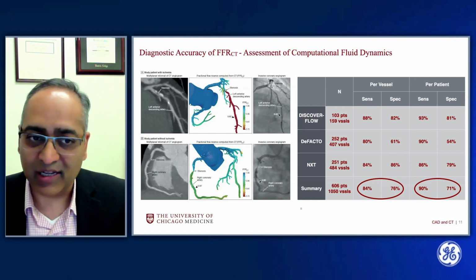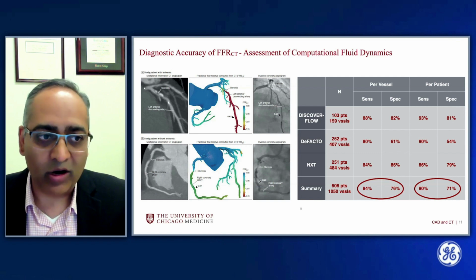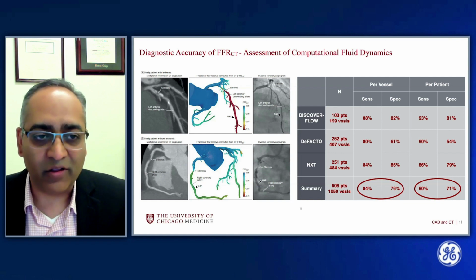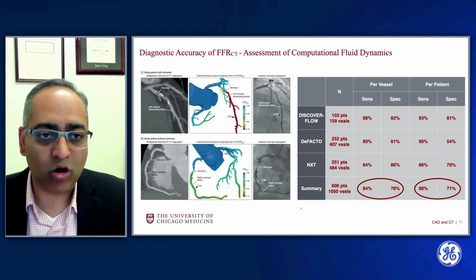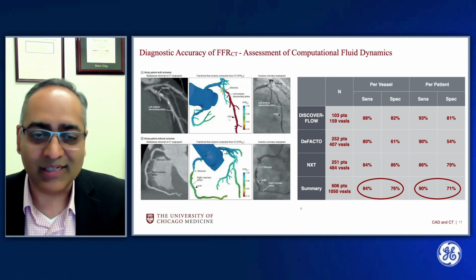I don't have to explain to this audience that with coronary CT, it is now possible to calculate throughout the coronary tree the CT-FFR values non-invasively from the images that were already acquired. So here you can see coronary CT in the proximal LAD. You see what appears to be a significant stenosis. And sure enough, on the CT-FFR, you can see a sudden drop in the CT-FFR value just distal to the significant stenosis. The FFR value by CT was measured to be 0.62.